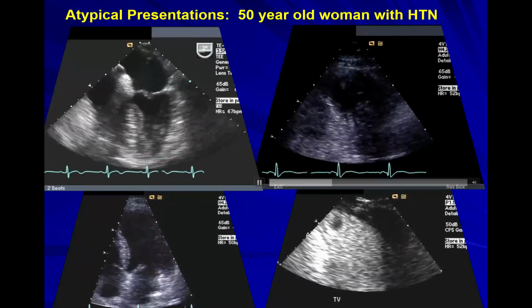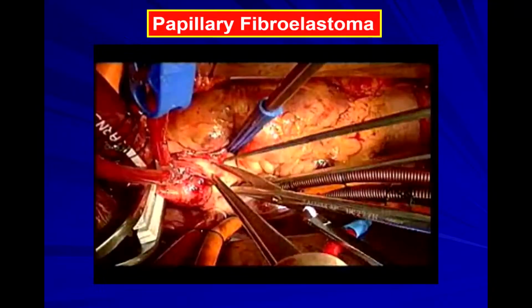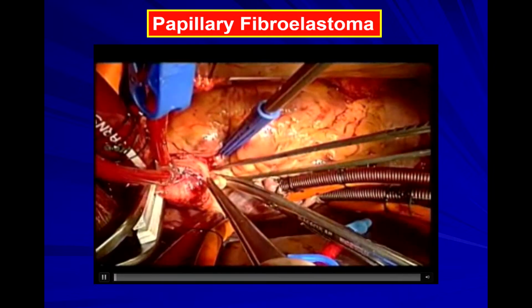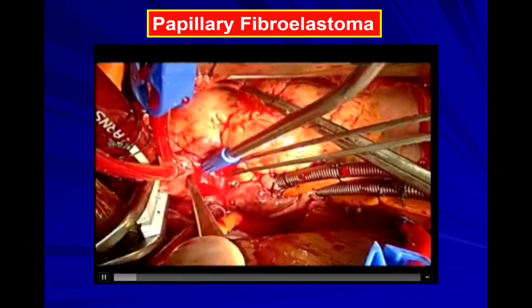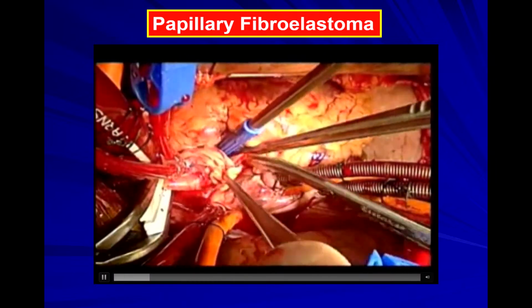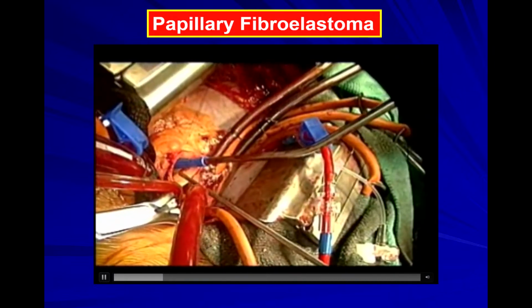So this particular lady had no symptoms, and this was an incidentaloma. She went to surgery. And this is a video of her surgery, courtesy of Dr. Michael Reardon. You can see that once he gets inside the left ventricle, you're going to see inside in just a second.